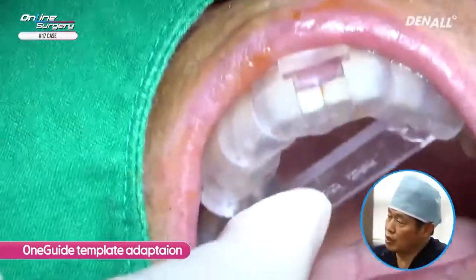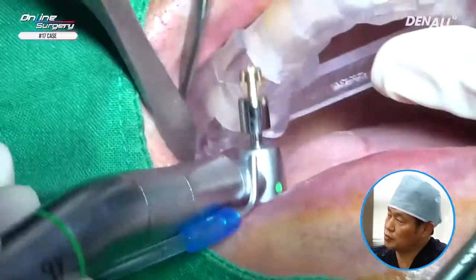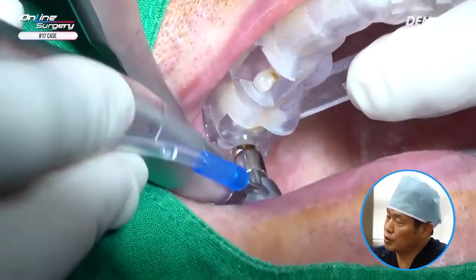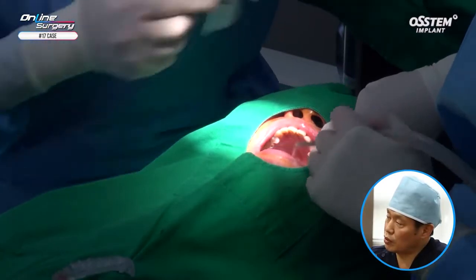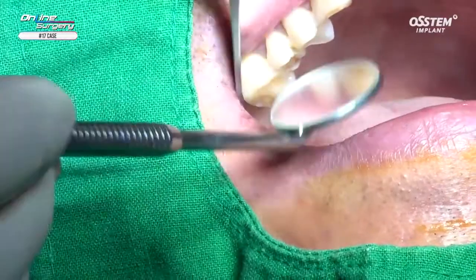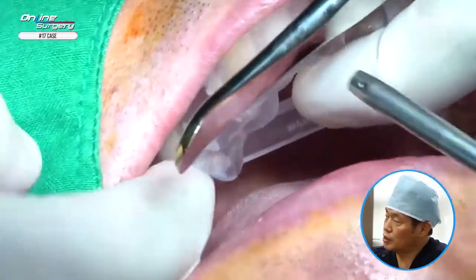The One Guide template has been adapted to see if it fits well. A mouth mirror is used to check whether the template is placed properly. I'm going to use Tissue Punch to remove the gingiva. In order to verify this was done thoroughly, I remove the template and check whether the gingiva has been removed properly, then use the mouth mirror again to confirm the punch has been done correctly.